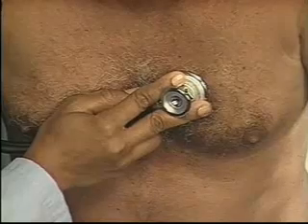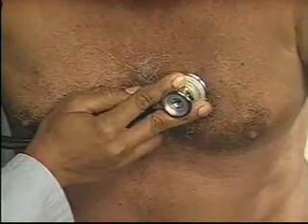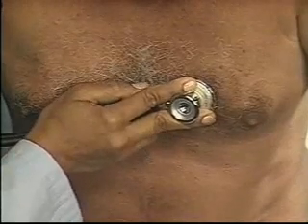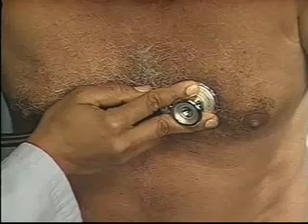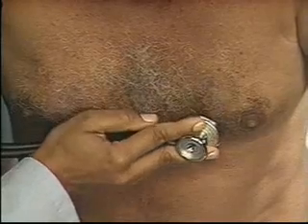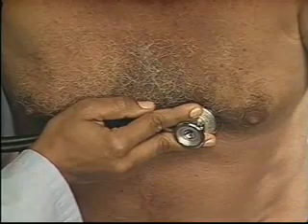Breathe out completely again and hold it. Pause periodically to allow the patient to breathe. Listen for the high-pitched diastolic murmur of aortic regurgitation. If the patient had this murmur, it would sound like this.